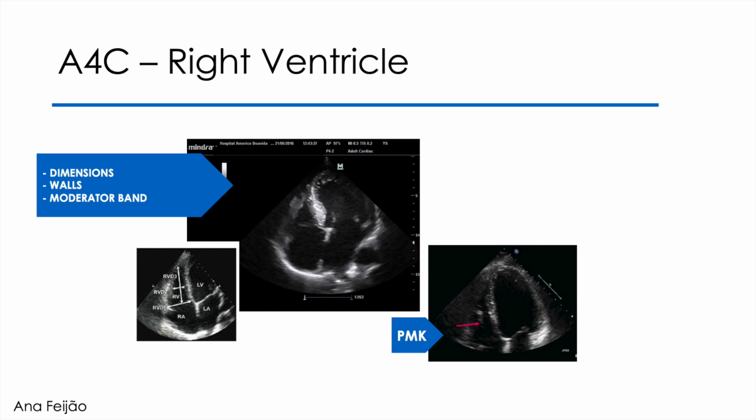The dimension of the right ventricle at the mid-level should be carried out transversely in the middle third of the right cavity, approximately in the middle of its longitudinal axis, always in telediastole. Do not forget that we must indicate in the report the location of the measurement.